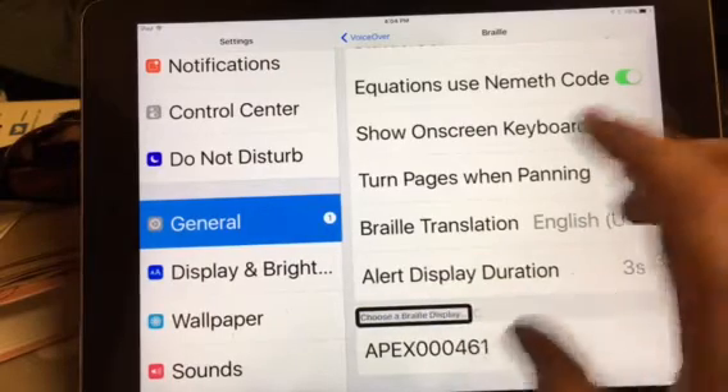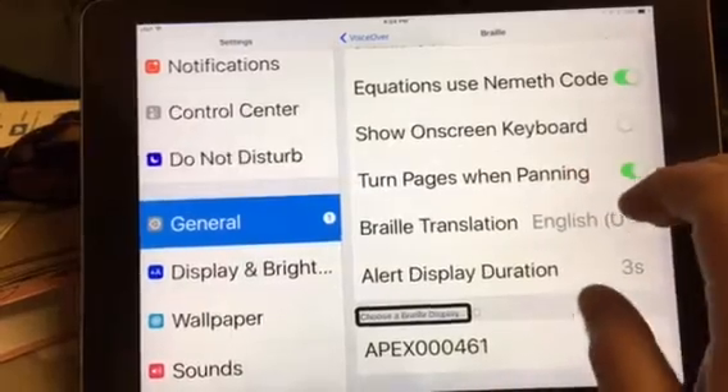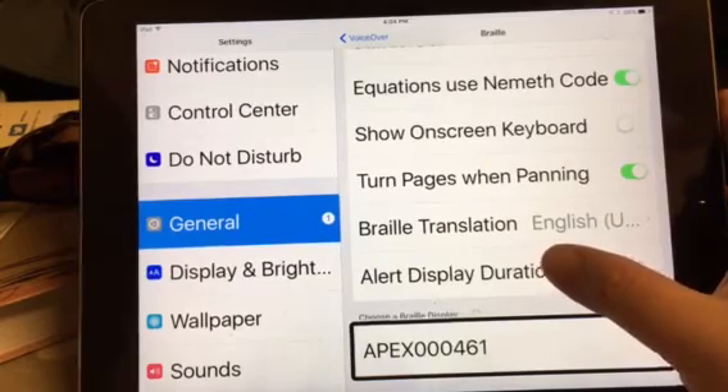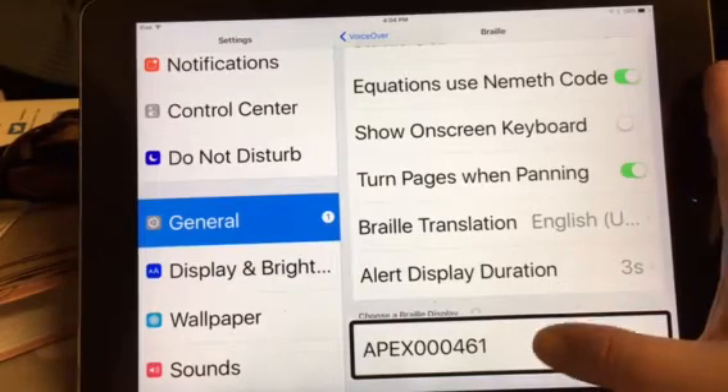So if there are any Braille displays within range, they'll pop up at the bottom. It says Apex — my Apex is not paired yet. So we'll double tap.